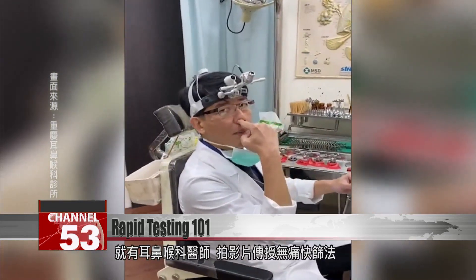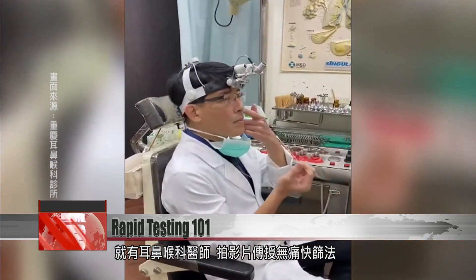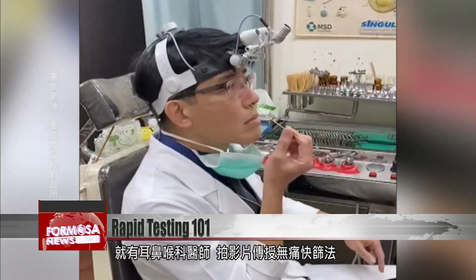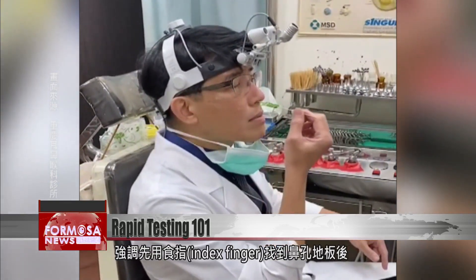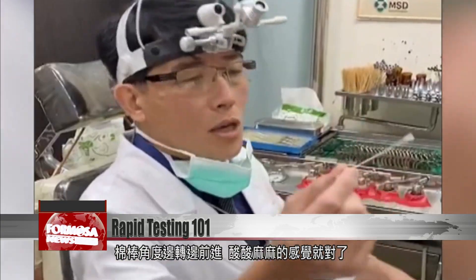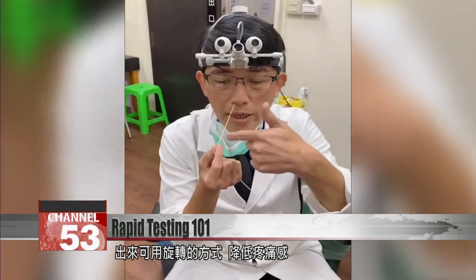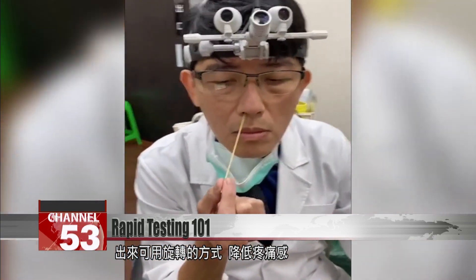This ear, nose and throat doctor released an educational video showing people how to correctly take a sample. To get it right, first probe your nose with your index finger. Then angle the swab, insert and rotate. If you feel a slight discomfort, you're doing it right, he says. To minimize pain when extracting the swab, twist it around as you pull.